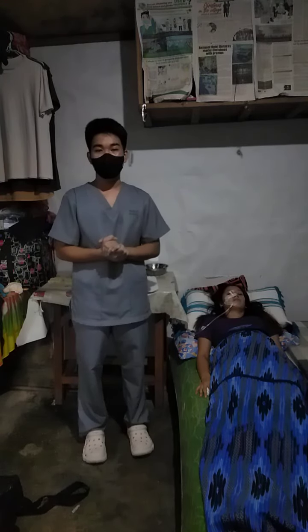So, good morning po, ma'am. I am Surab, your nurse for today po. So, may order po si Doc na tanggalin na po yung NG tube niyo po. Mag-operate lang po tayo, ma'am. Thank you po.